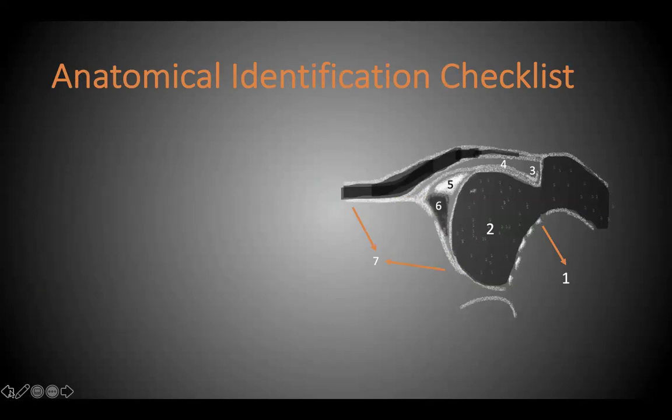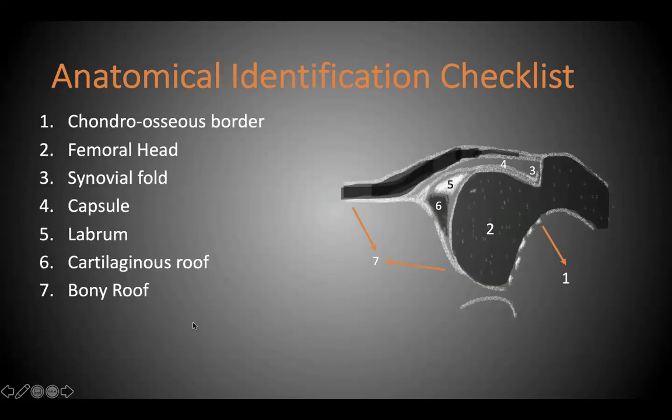And so with that, could you show us some examples of how exactly to get to the turning point? Because with some of the scans, when you said this is the turning point, I thought that something else was the turning point. So along with that roof thing, maybe if you could show us.